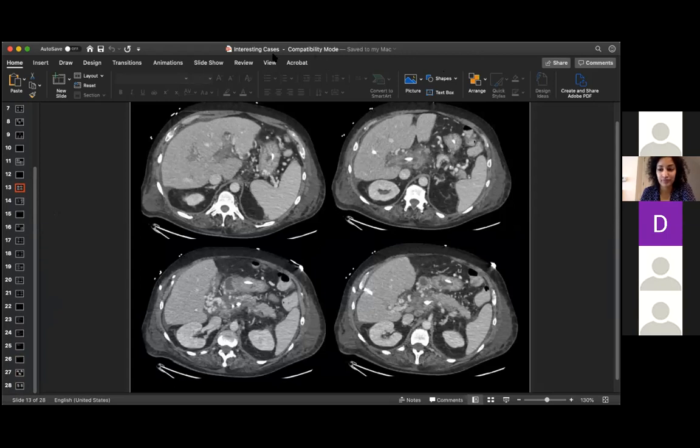Do you know how commonly acinar tumors are cystic or necrotic versus more solid looking like this? They often have cystic changes and internal necrosis, more often than not, which is why they say that they look like SPEN, because SPEN is often partially solid, partially cystic. But probably because they're so big, they outgrow their blood supply. Exactly. I think when they're smaller, they look solid, and both SPENs and acinars, as they get bigger, get more cystic looking, although for the SPEN, it's hemorrhage.